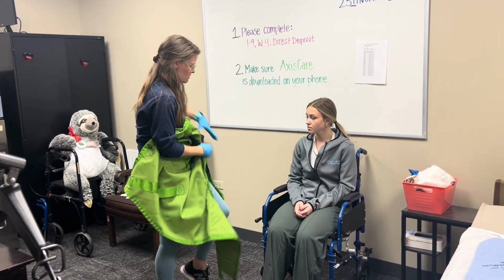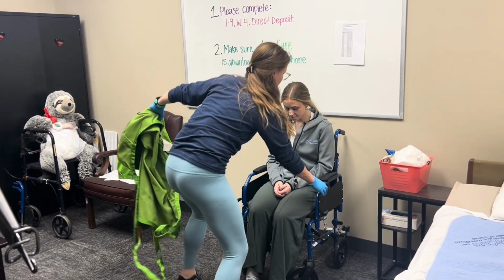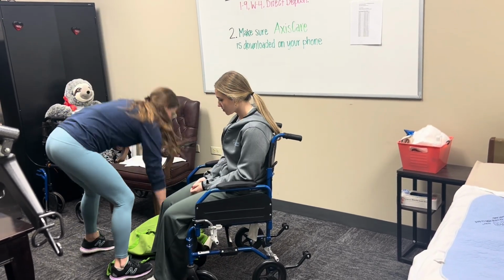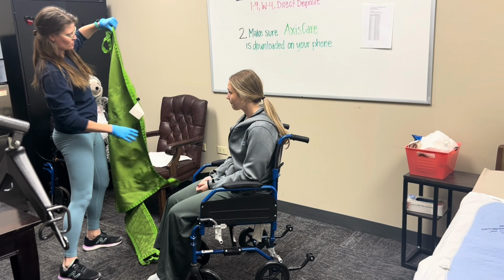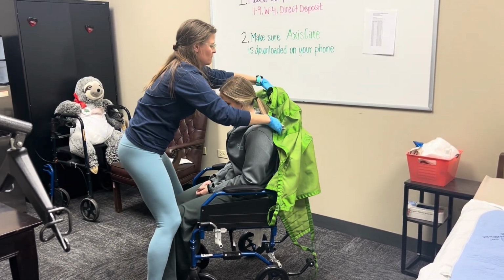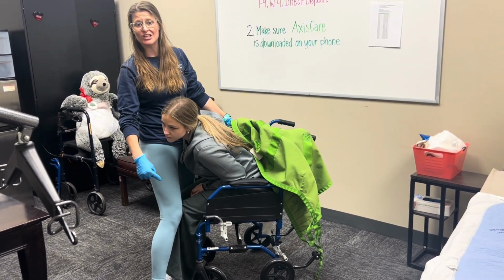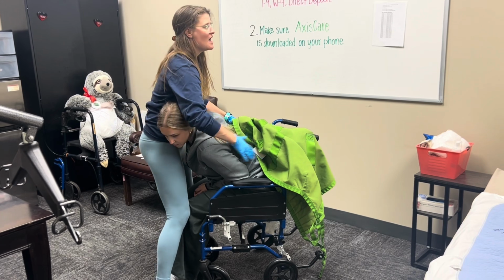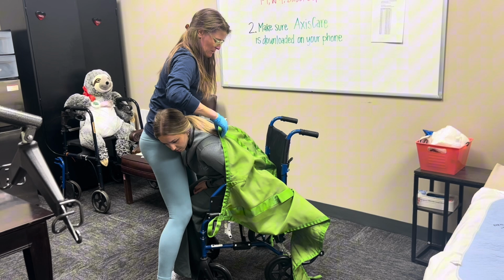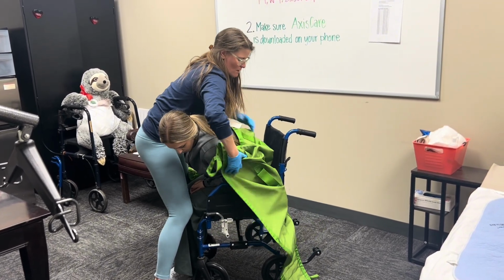What I'm going to do for a better angle. So I know that this is the outside edge. What I'm going to do is I'm going to stand in front of my client. Miss Michaela, can you lean forward? I want my client to lean as far forward as she feels comfortable. She cannot go anywhere because she is getting blocked. Her legs are being blocked by mine, and I have multiple points of contact. So I want to try to shove this as far down as I possibly can. Okay, we can lean back.